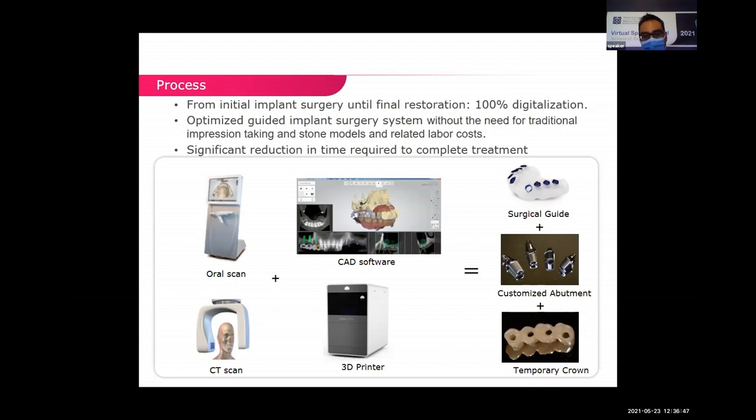The thickness of the gingiva is key to delivering the final abutments exactly after the surgery is done.